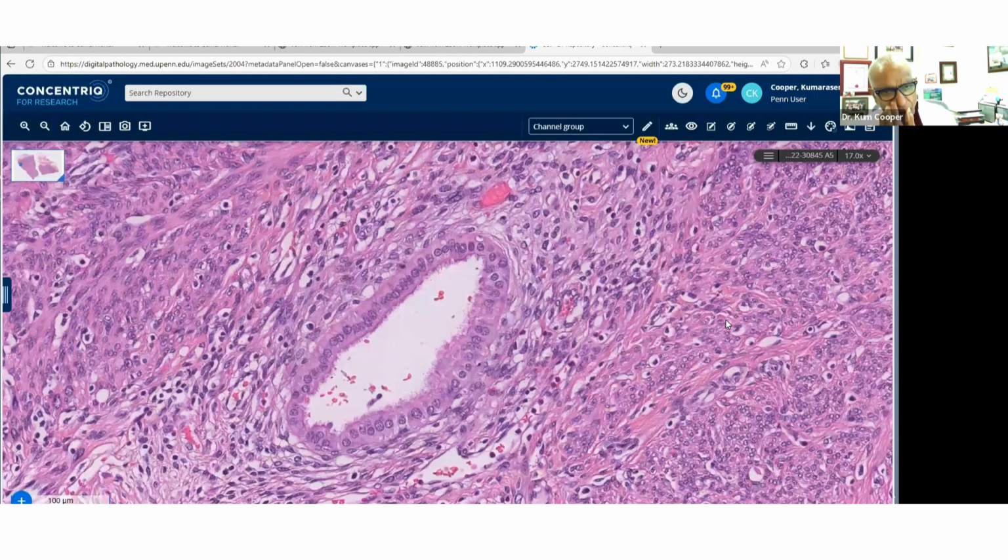So when you think about adenomyomas in the GYN tract, remember they occur typically in the cervix, smooth muscle, and then these bland, benign glands in that. So like I said, we can debate whether it's endosalpingiosis or just part of the adenomyoma. But they're all great questions. I went for just adenomyoma. Is this a typical pattern? Yeah, I think so.